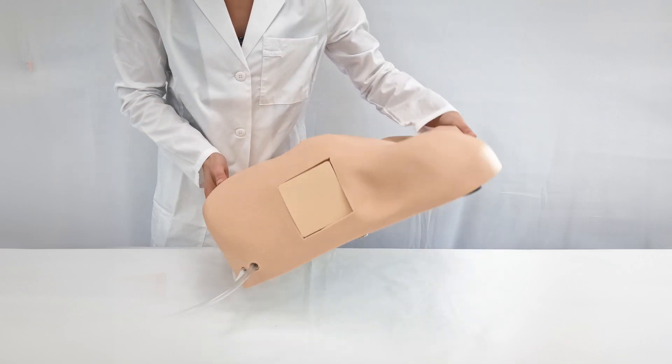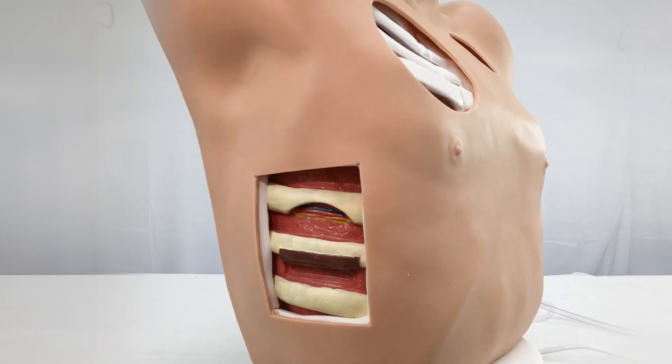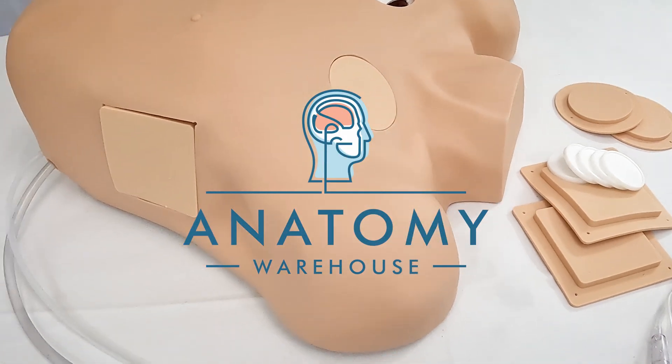It can be used in a sitting or supine position. This simulation model sets itself apart through unsurpassed value, versatility, and a generous one-year warranty. It is ideal for repeated practice and training sessions. The Chest Drain and Needle Decompression Trainer, available exclusively from Anatomy Warehouse.